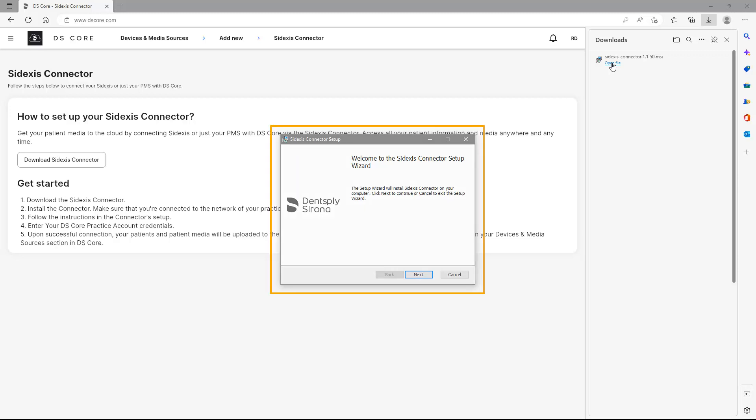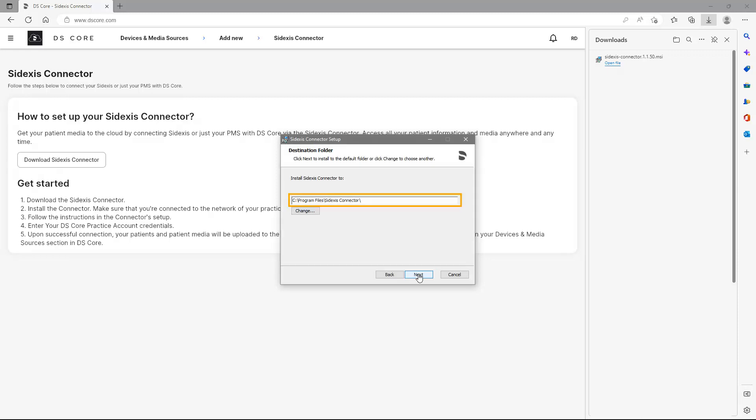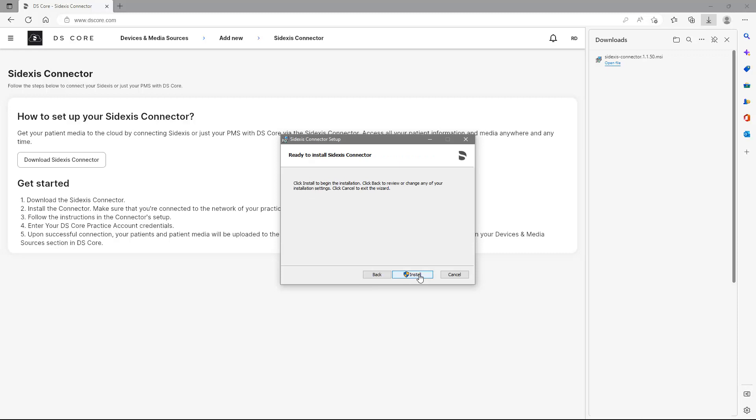Now, the Sidexis connector setup wizard appears. We follow the instructions and the setup wizard will install Sidexis connector on your computer. We tap Next and the default folder for the installation is chosen. By tapping Change, another folder can be chosen. We confirm with Next and start the installation by tapping Install.